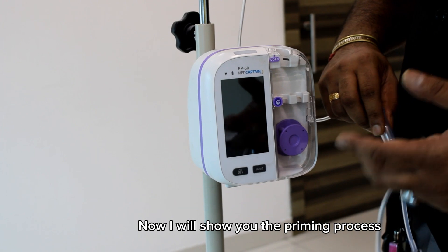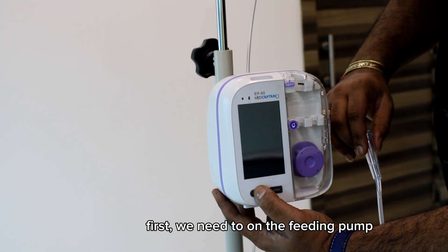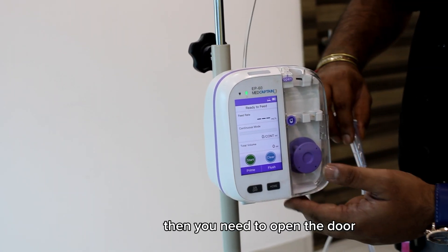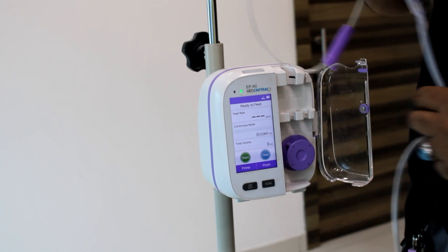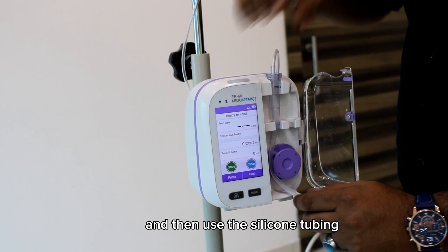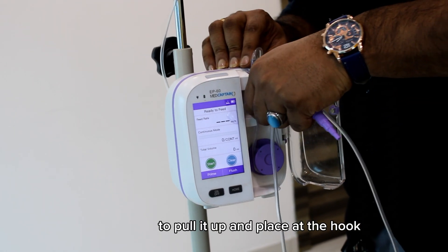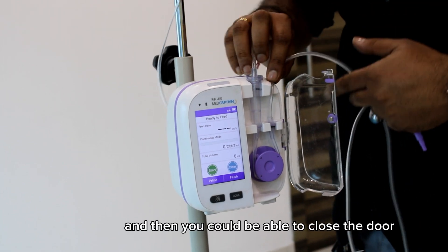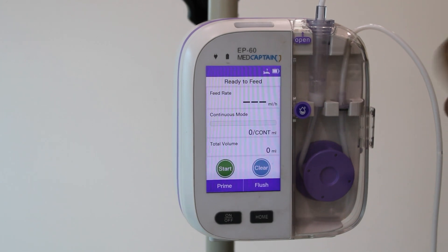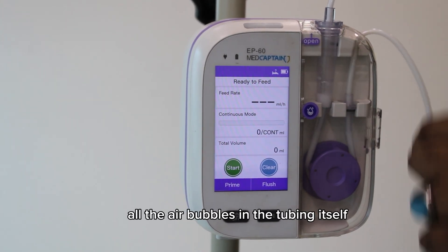Now I will show you the priming process. First, turn on the feeding pump. Then open the door and place the chamber accurately — push it in, use the silicone tubing to pull it up, and place it at the hook. After closing the door, the priming is done, meaning all air bubbles in the tubing have been released.